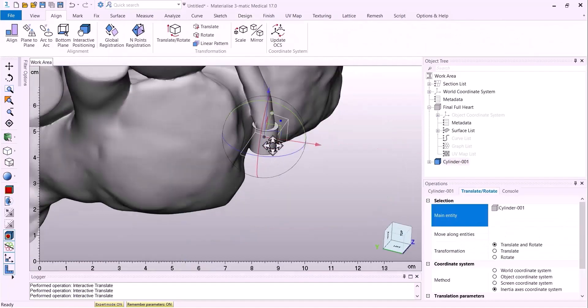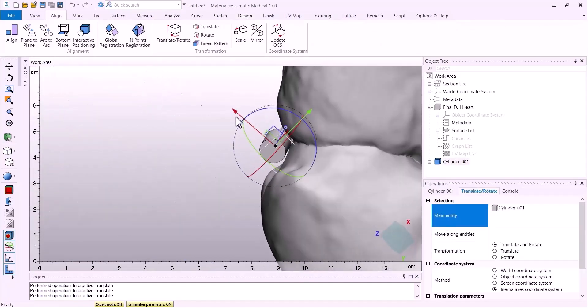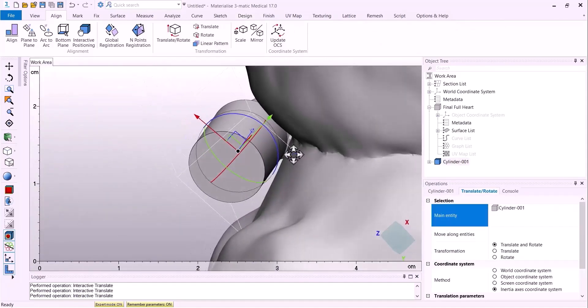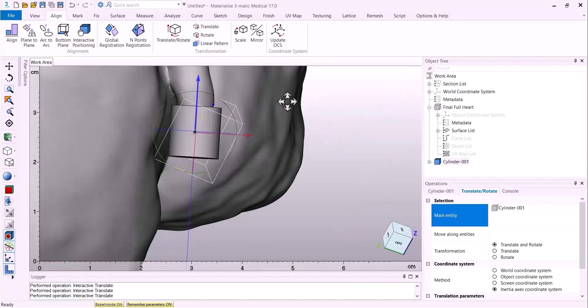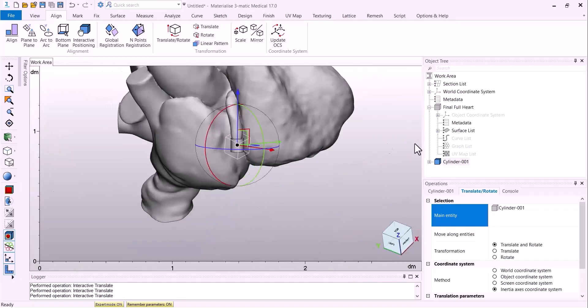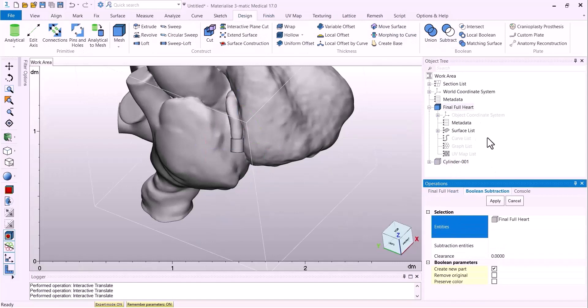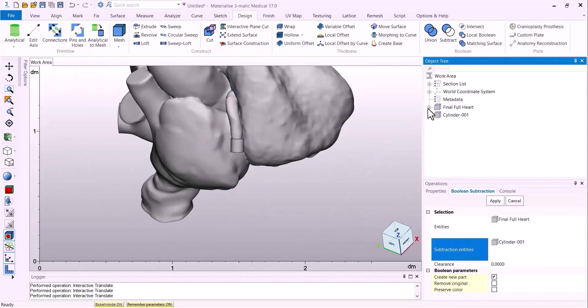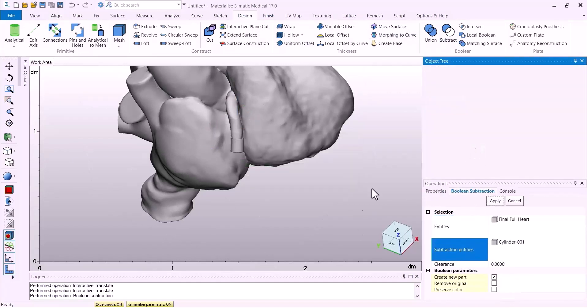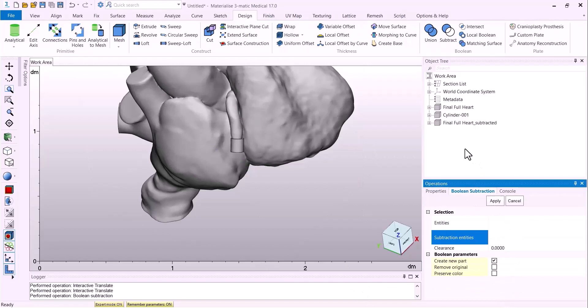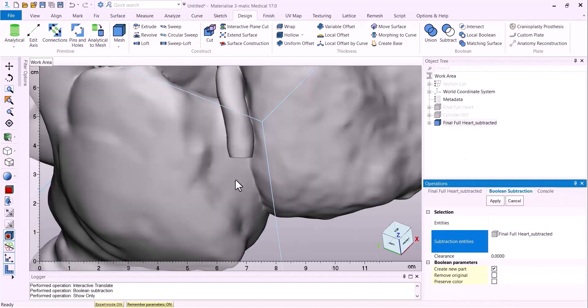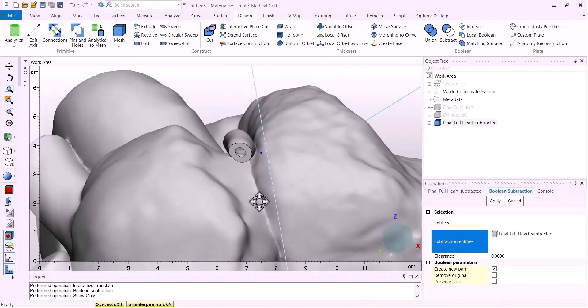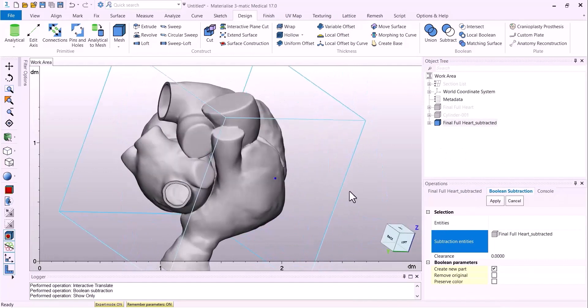You can use a cone, a box, a sphere, or any other object or anatomical model to create this type of cut. This can also be done to create windows. In this case, once we have our aligned cylinder, all we have to do is subtract it from the model and we will have our cut open surface.